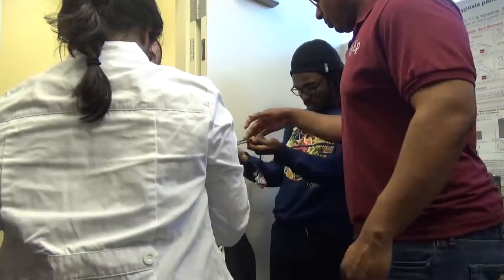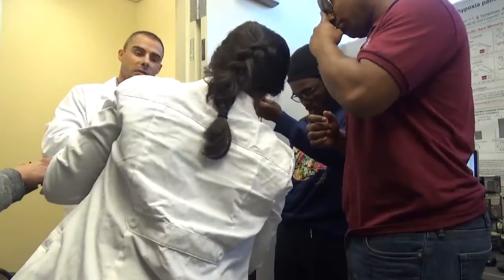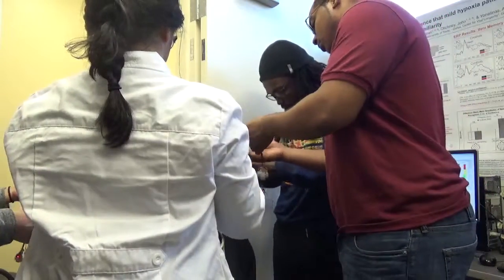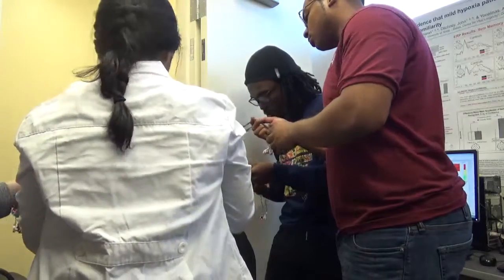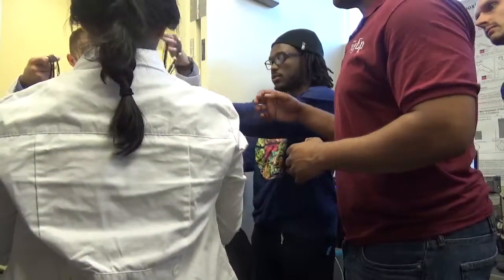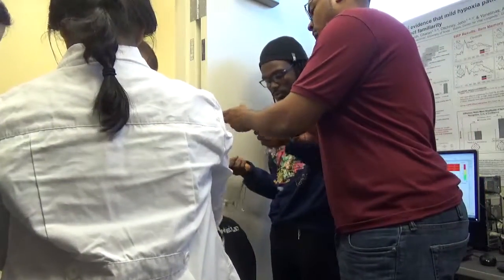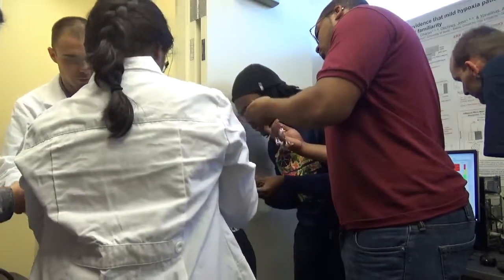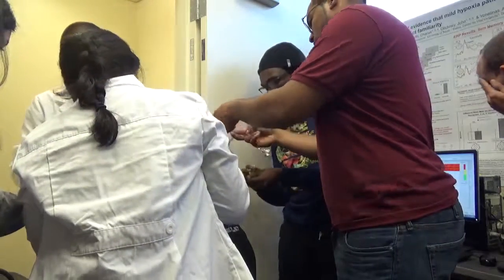Now, notice that we have a little clip back here. This box, the splitter box, gets a little heavy, and so generally, we can clip it onto, you know, if they have a hood or something like that. Actually, you know what? These need to reverse to the other side. There you go. Sorry about that. Let me just clip this onto the hood. Okay. There we go. And I'll help with some of these.